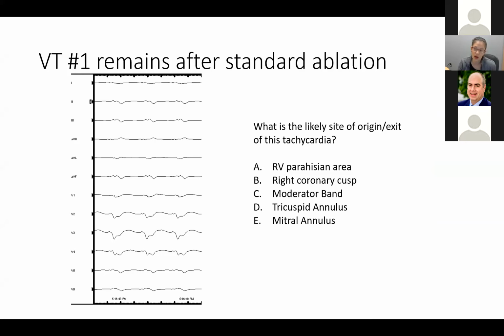Right, right. So as part of this, the needle catheter is still under IDE, and the requirement is that the patient has to have failed one previous catheter ablation, and they cannot have epicardial ablation at the same time as the needle catheter ablation. So oftentimes these are folks that are referred from an outside hospital after an unsuccessful ablation anyway. So we're usually doing both needle catheter ablation and standard RF for those redos. We're allowed to do both, but we're not doing epicardial ablation.